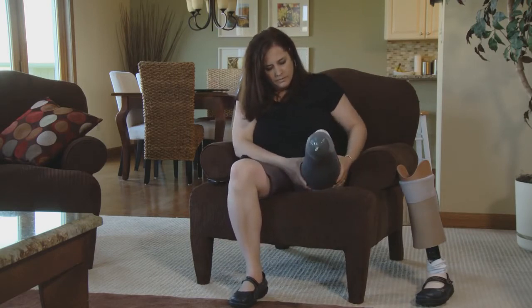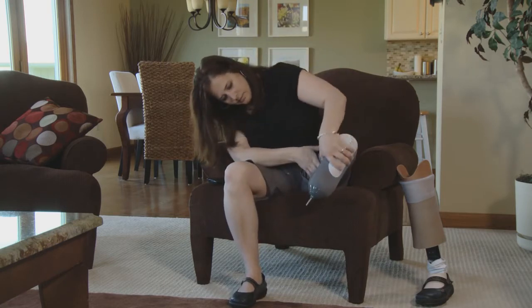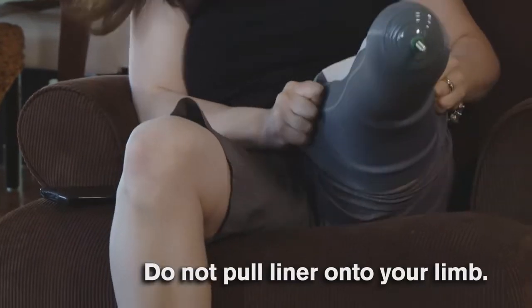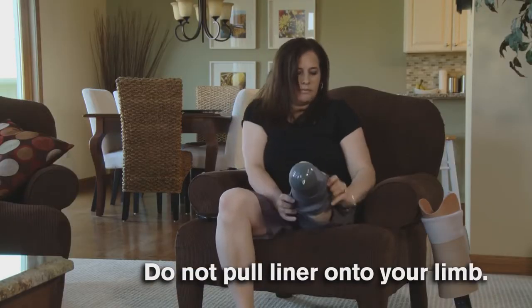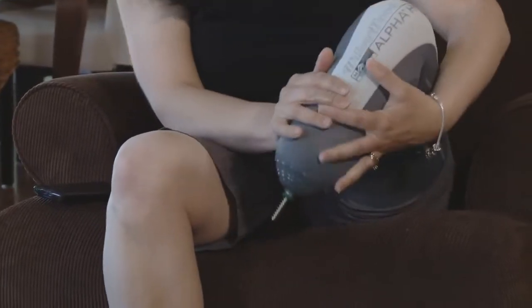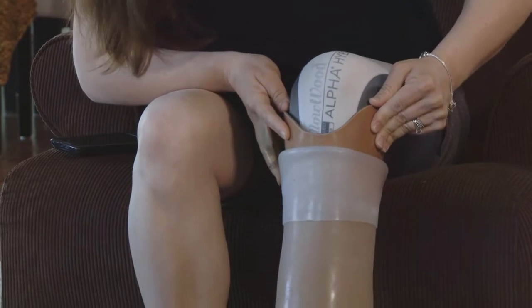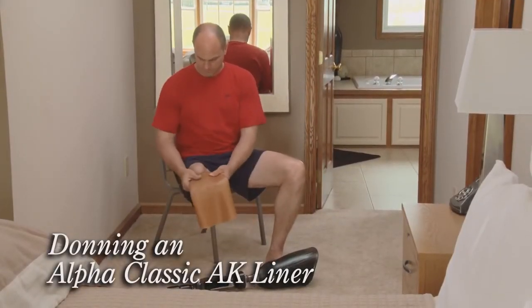For optimal comfort, position the seams away from any sensitive areas or bony prominences. Make sure that the liner is rolled, not pulled, onto the limb. Pulling the liner may stretch the skin and result in an uncomfortable fit. Make sure that there are no wrinkles or air pockets between your residual limb and the liner, and then don your prosthesis.